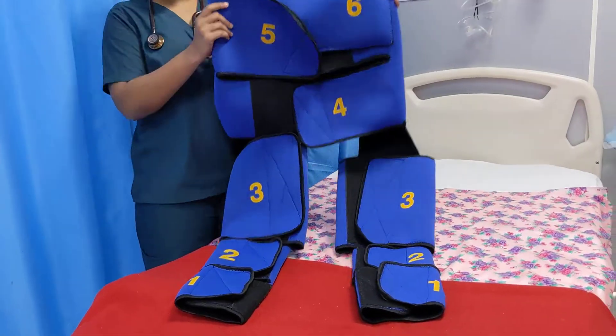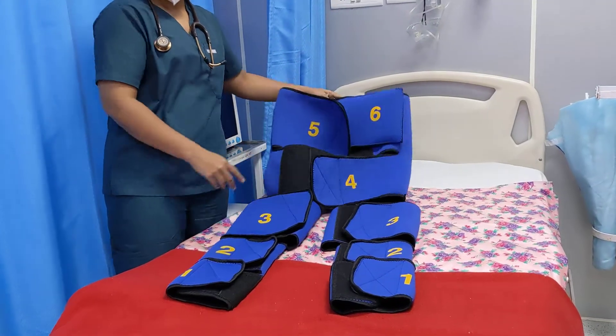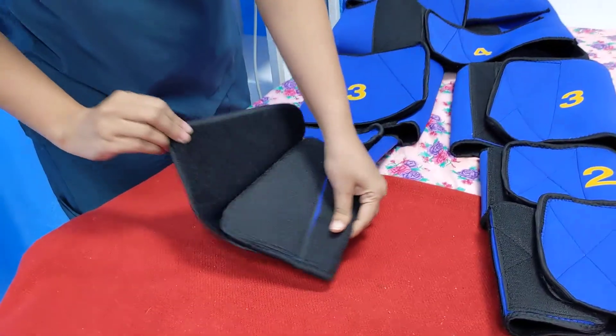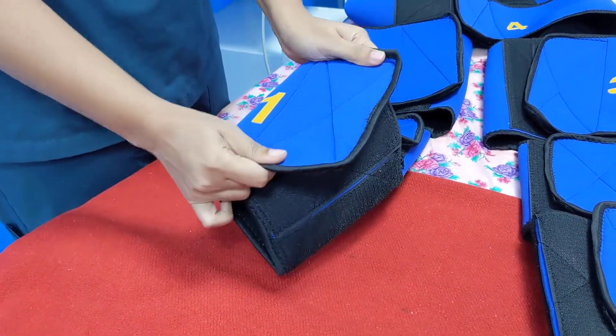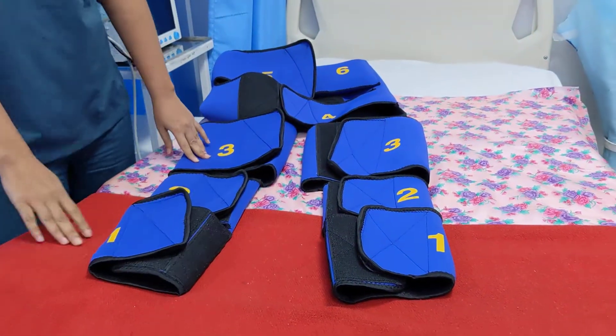This NASG is a lightweight, washable, and reusable, relatively inexpensive garment made up of neoprene and velcro. This neoprene is the same material used to make the suits worn by astronauts during space travel.